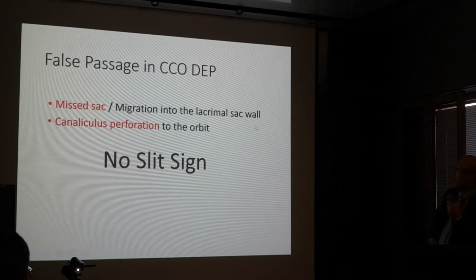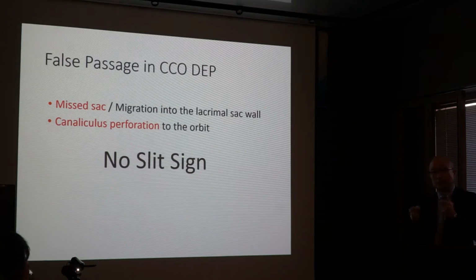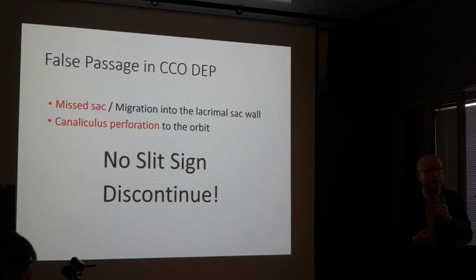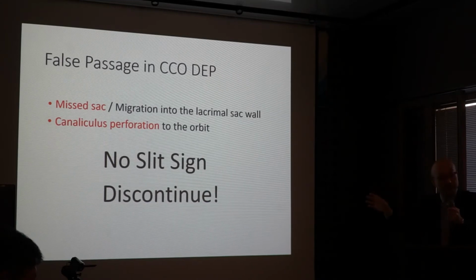And if a false passage occurs, we should discontinue. If we continue, maybe there is some problem, including acute or chronic inflammation. But if you discontinue, no problem, and wait 2 weeks, then you can try it again.